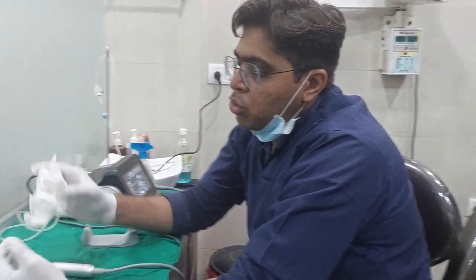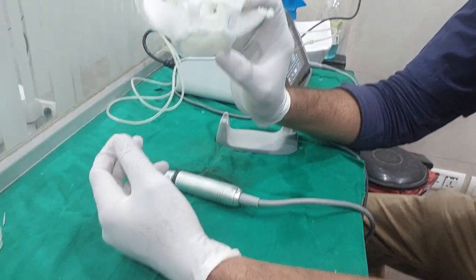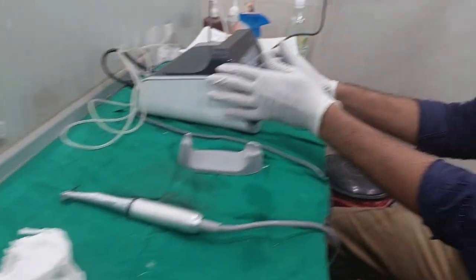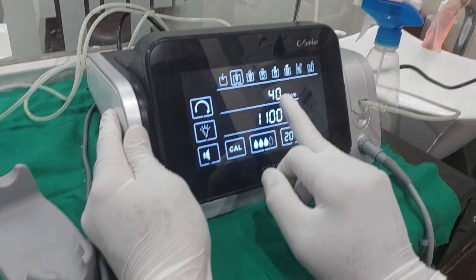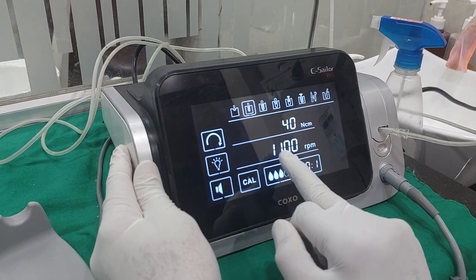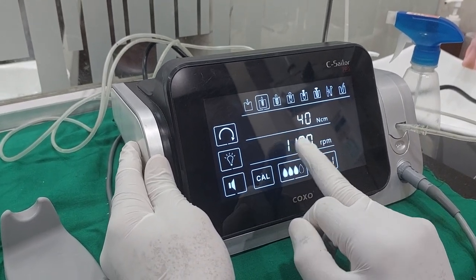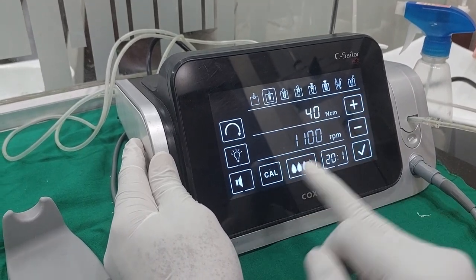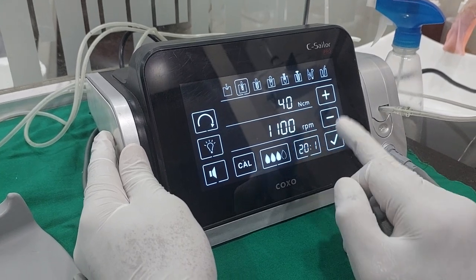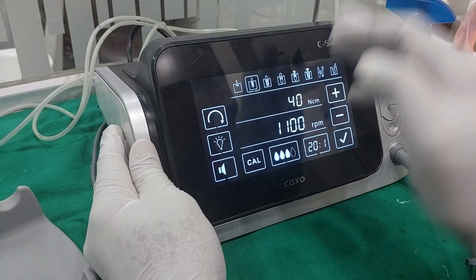Today I am going to show you a pterygoid implant placement on an STL model. This is the physio dispenser. My setting is about 35-40 Newton torque, speed 1100, but in the maxilla, sometimes according to bone density we have to choose a little less. Initially I will do at 1100, and after piercing, if bone density is soft, I will reduce it to 800.